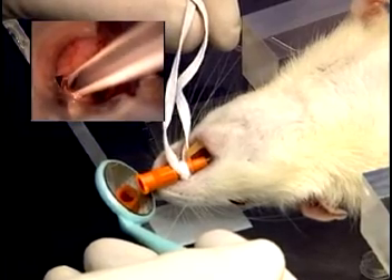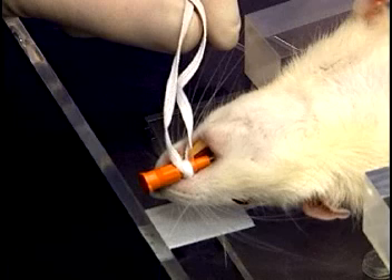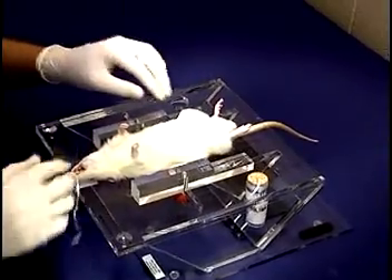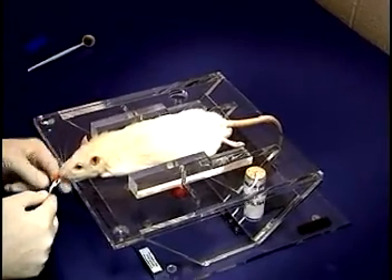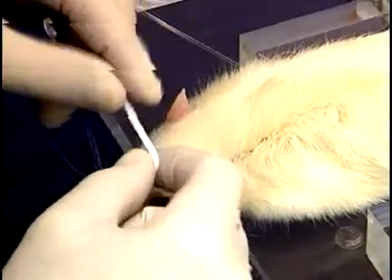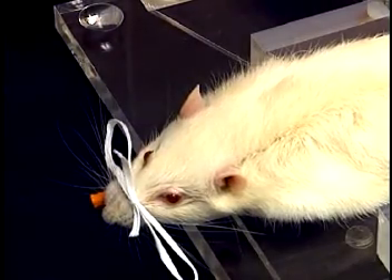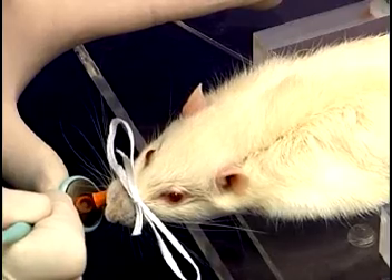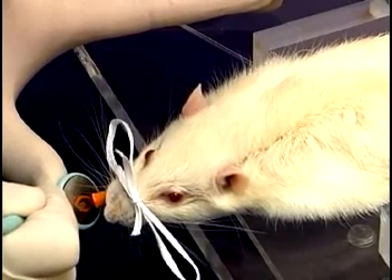The fogging seen in time with respiration indicates that the tube is correctly placed. If the tube has been misplaced, a second attempt can be made. However, repeated attempts will lead to trauma with swelling and respiratory compromise. Following a failed second attempt, it is safer to allow the animal to recover and try again another day. The rat is carefully turned to the prone position. The ties are secured behind the whiskers and over the nose. There is some risk of extubation when the ties are secured, so it is wise to again confirm intubation before connecting the rat to a breathing circuit.